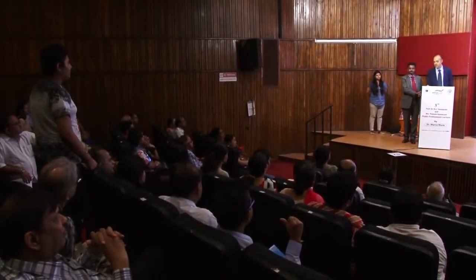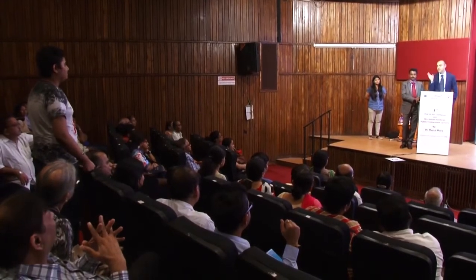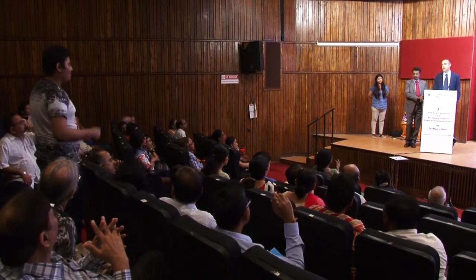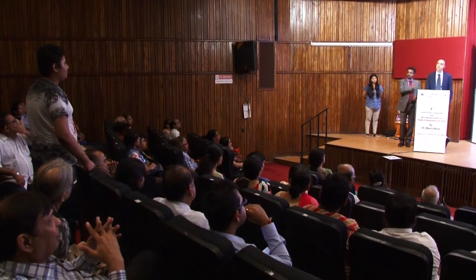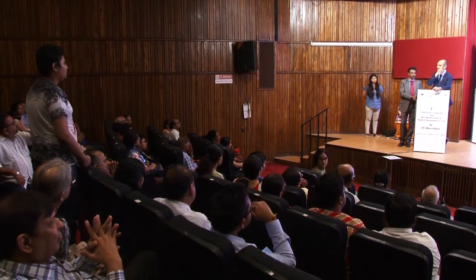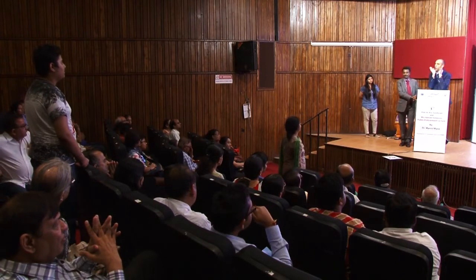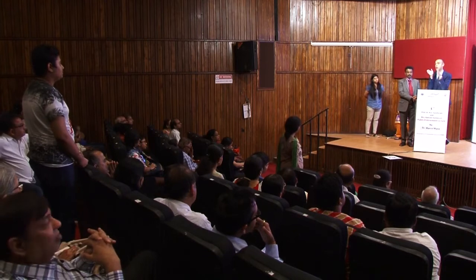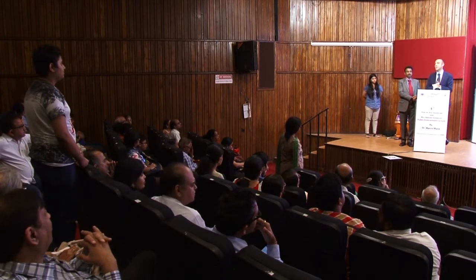The shaky vision, nystagmus, is not a problem for the implant. The problem is that your vision is so good that you don't need an implant. Most patients with RP, almost everybody, have nystagmus, and there is absolutely no problem with that. The only issue is that in the implant there is a little antenna, and in the glasses there is a little antenna. If somebody has a very large nystagmus, the antenna can sometimes move far from the antenna in the glasses, and you can lose connection. But that can be trained, and usually after training the nystagmus almost stops or becomes very little. So there is no lag in the image. At the beginning you may lose the signal, but it improves with training.